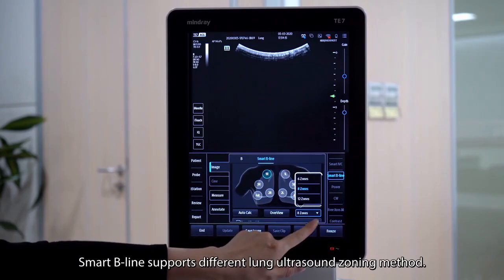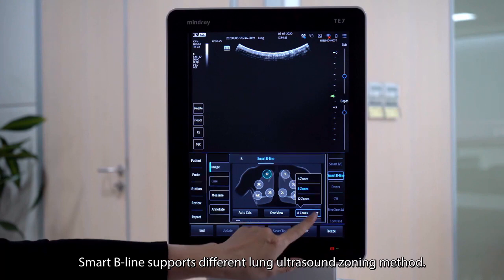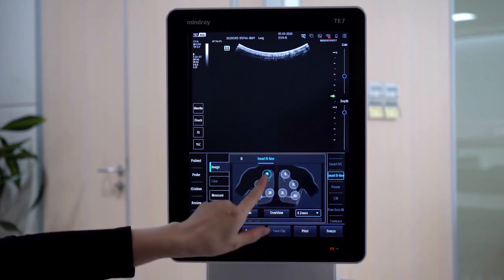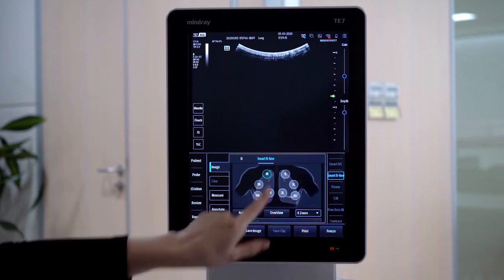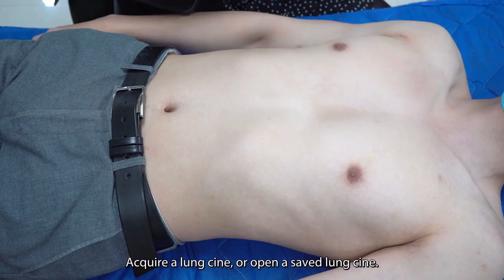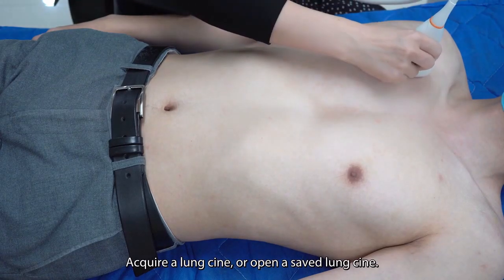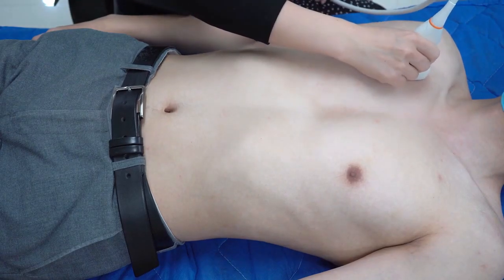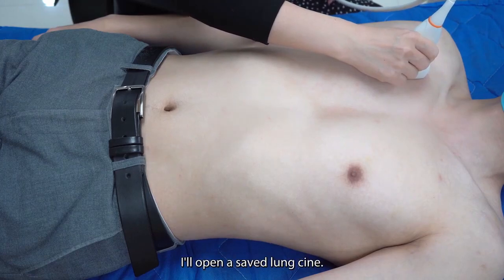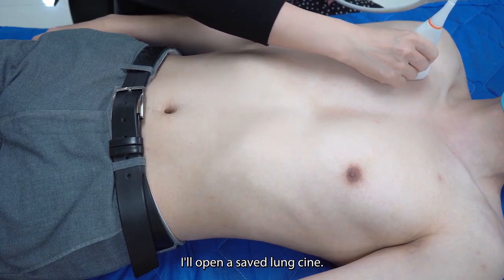Select a lung zone. Smart B-line supports different lung ultrasound zoning methods. Acquire a lung cine clip or open a saved lung cine clip. In this demonstration, I will open a saved lung cine clip.